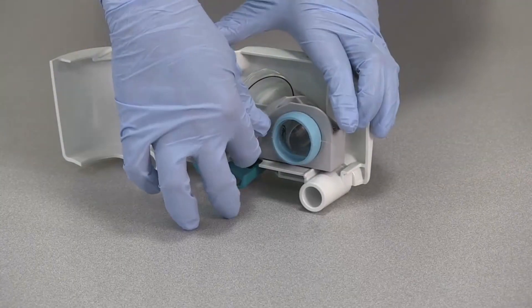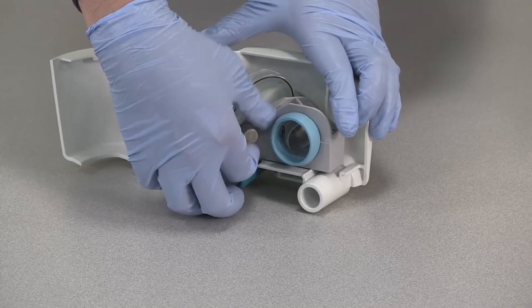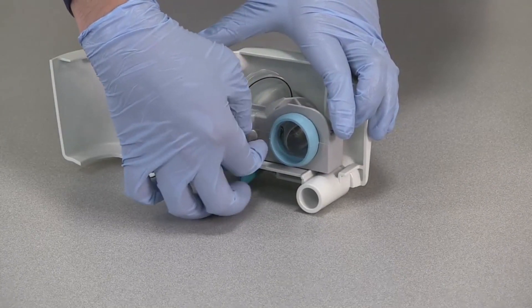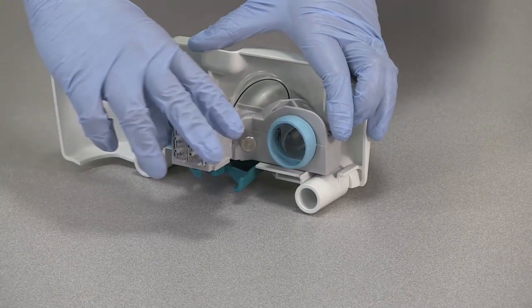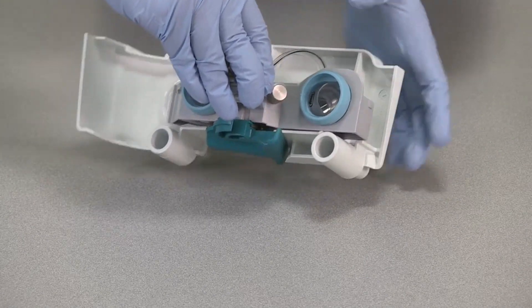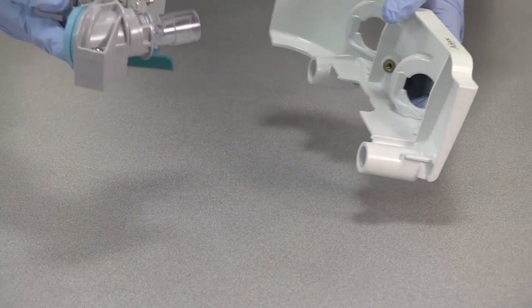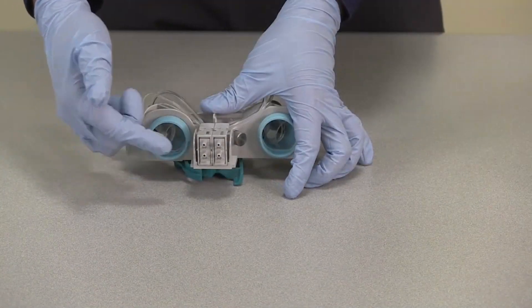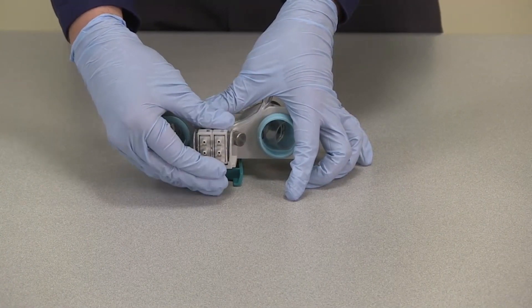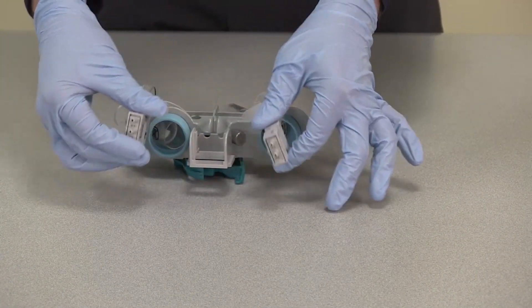To remove the flow sensors from the module, first completely loosen the thumb screw. Pull off the flow sensor cover from the flow sensor holder. Remove the flow sensor connectors from the flow sensor holder.